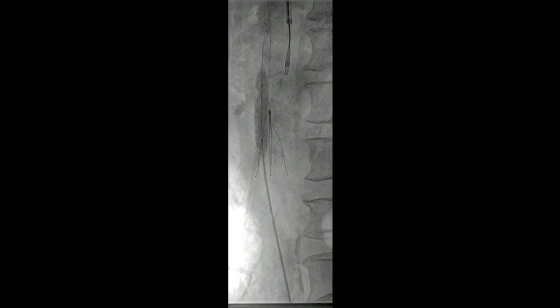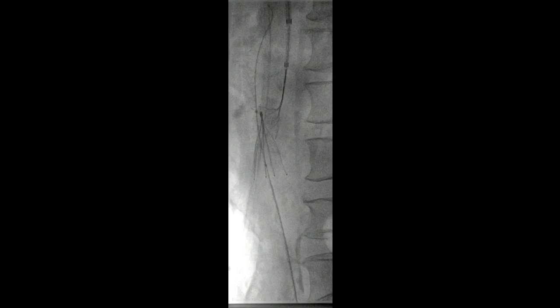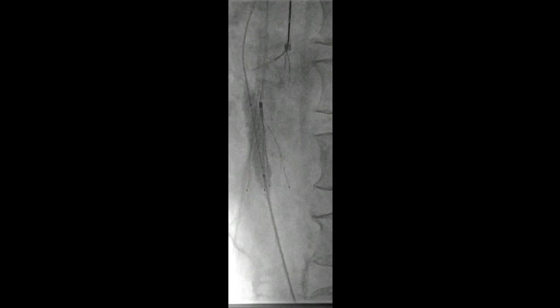There are a couple of ways: you can either try and ride the snare down along the balloon, or you can pull the snare back, put the wire from the balloon up through the snare, and then ride down the wire as you retract the balloon to see if it will bring the snare down on top of the hook itself. Repositioning the snare, trying to bring a wire up through it — you don't have a lot of control over those wires. Here it looks like it's on it but we still can't get a hold of it.